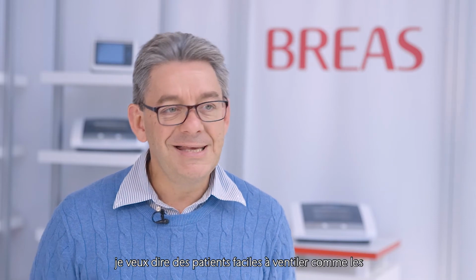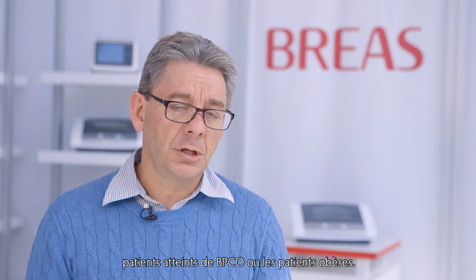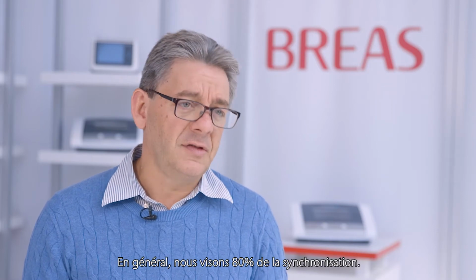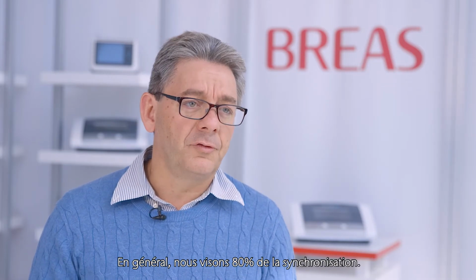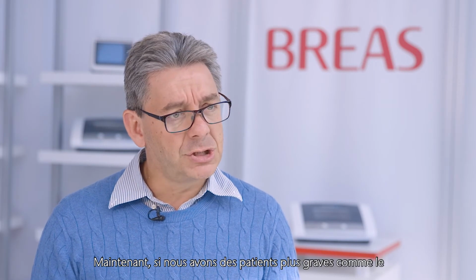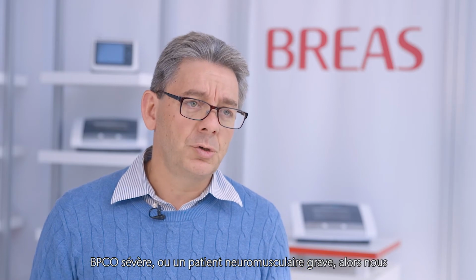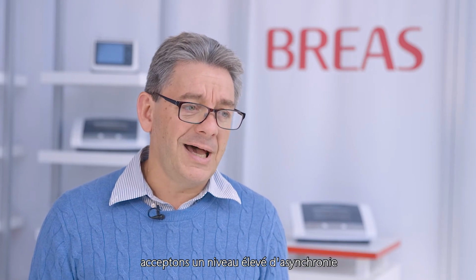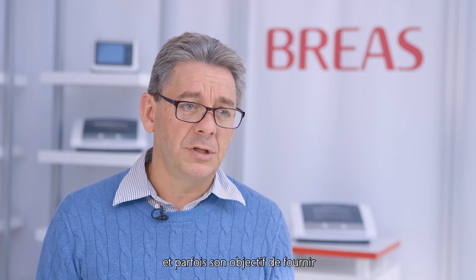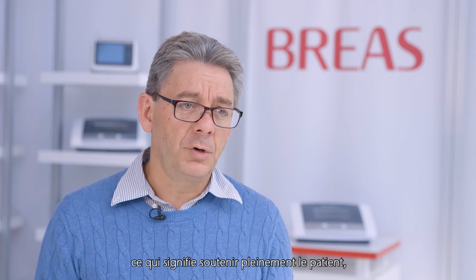I mean, for easy to ventilate patients such as COPD or obese patients, usually we target 80% of synchronization. Now, if we have more severe patients such as severe COPD or severe neuromuscular patients, then we accept a high level of asynchrony, and sometimes it's a goal to provide a mandatory breath, meaning to support the patient fully, which means 100% of asynchrony.